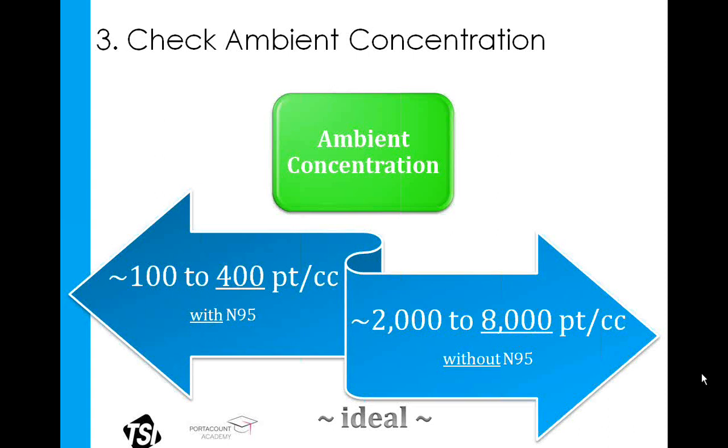Keep in mind that a particle generator is viewed as a necessary evil. We would prefer that you not have to use one at all. And you may find that a particle generator is only necessary on certain days, or it may only be necessary in the morning. And then people get into the office, they're moving around, and you don't need a particle generator anymore. It may only be necessary on humid days. It's something that you'll have to play around with. But, for example, on a dry day, it might be producing too many particles, and again, that could cause a problem passing our zero check.